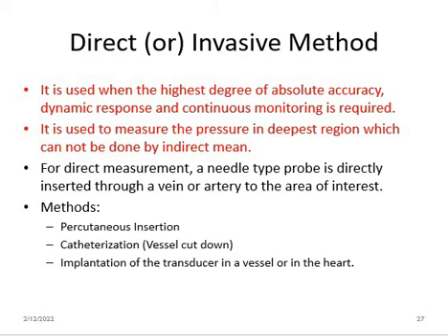Again, this direct method has three types. One is percutaneous insertion. Another method is catheterization.